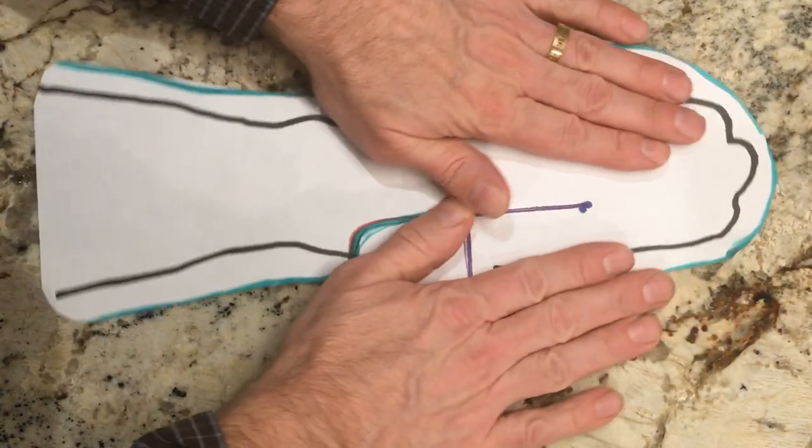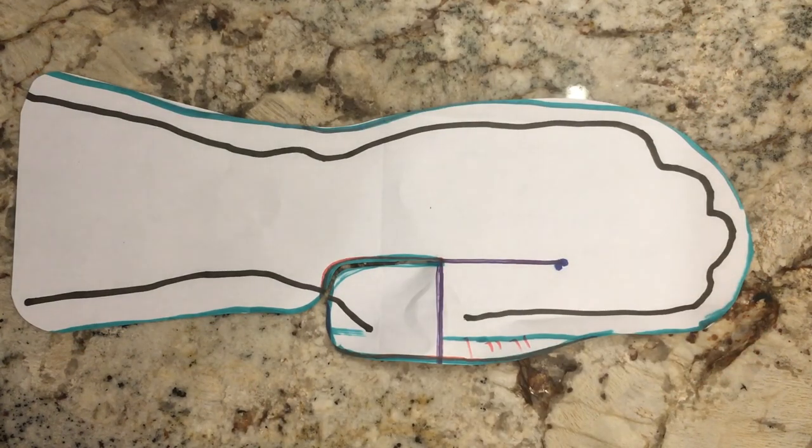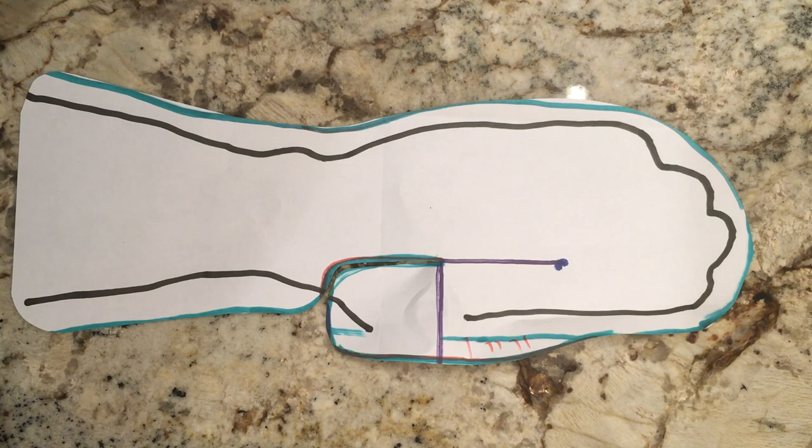So that is the process of making the pattern for your resting pan orthosis, or another name for it is the volar wrist hand orthosis.